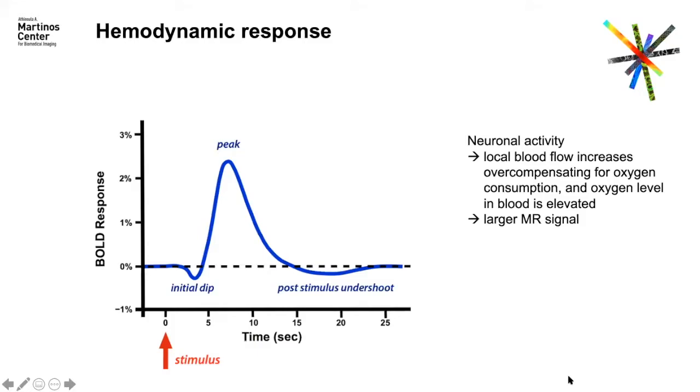There are also two smaller peaks, initial dip and post-stimulus undershoot.